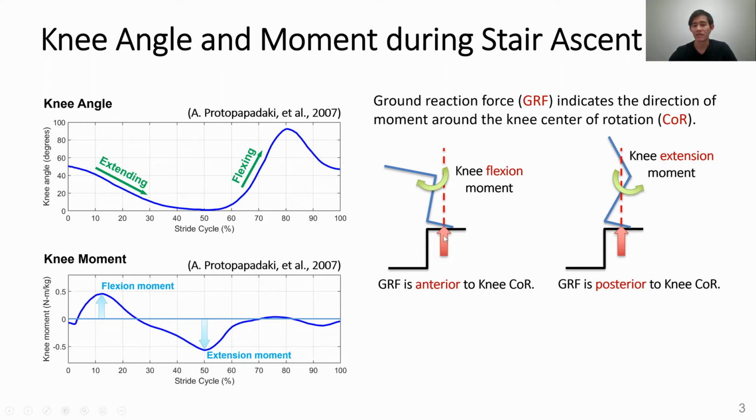In the early stance phase, we require the flexion moment, which is a positive moment in the moment plot. And in the latter stance phase, the extension moment is required.